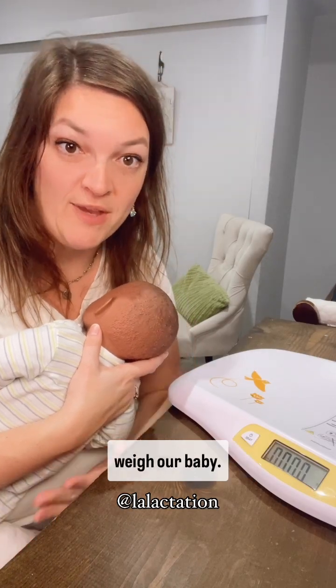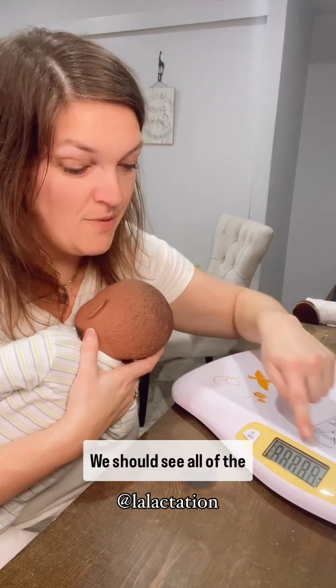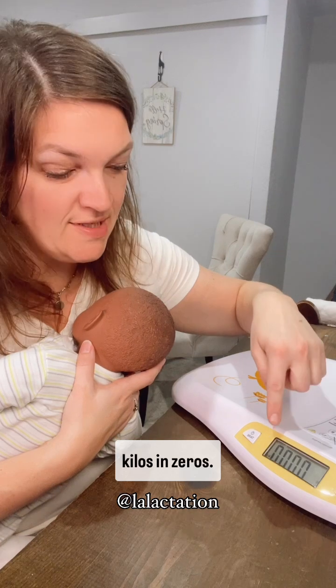All right, so now we're ready to weigh our baby. We have our scale and we're going to turn that scale on. We should see all of the numbers. Now I have it in kilos and zeros.